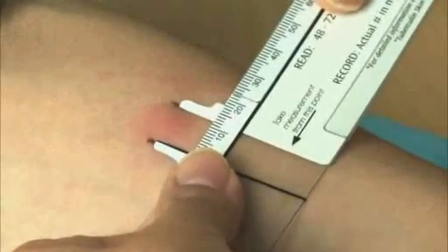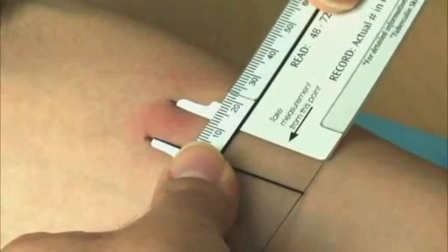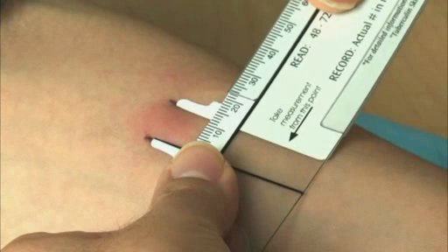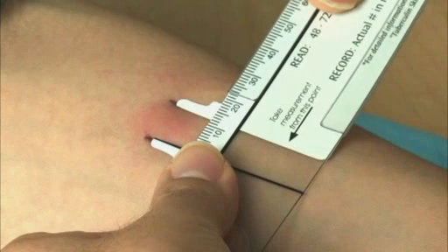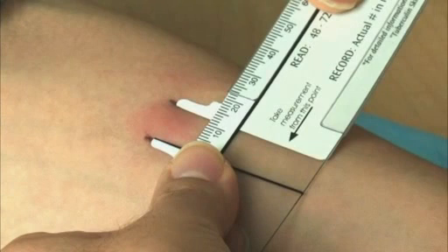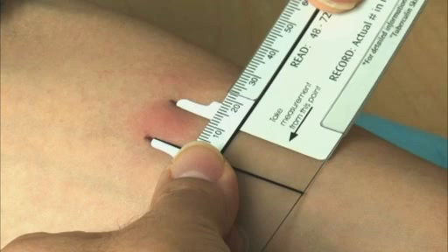Take the TB skin test caliper ruler and place the 0 mm line inside the left dot edge and read the ruler line to the inside of the right dot edge. This will be your measurement in millimeters of the induration.